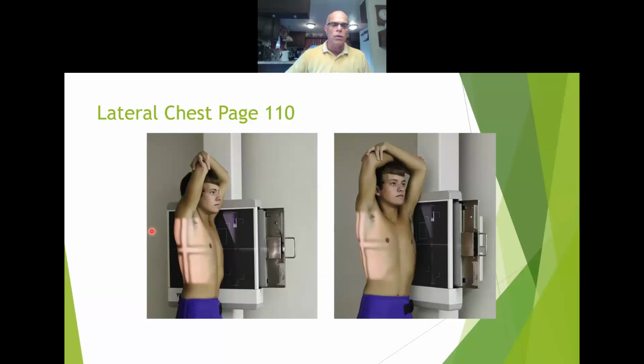So now our horizontal line, you're going to feel on his back. You're going to feel the bottom tip of the scapula. And also remember that's T7, inferior tip of the scapula, T7, and also lines up with the nipple line. So we have inferior angle of the scapula, T7, and in the front we have the nipple line. And obviously this vertical part of your crosshair is going to be on the MCP, mid-coronal plane.